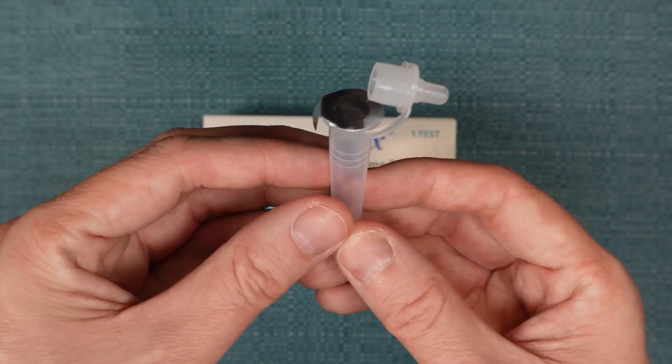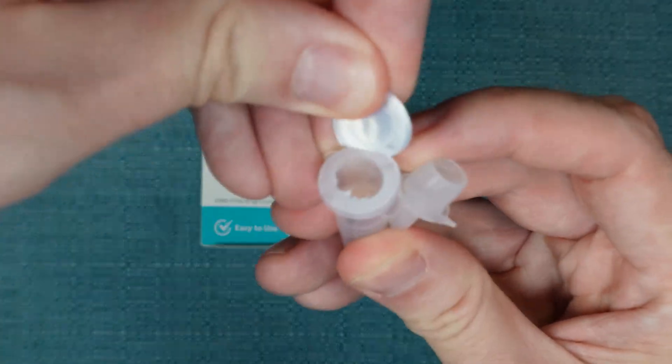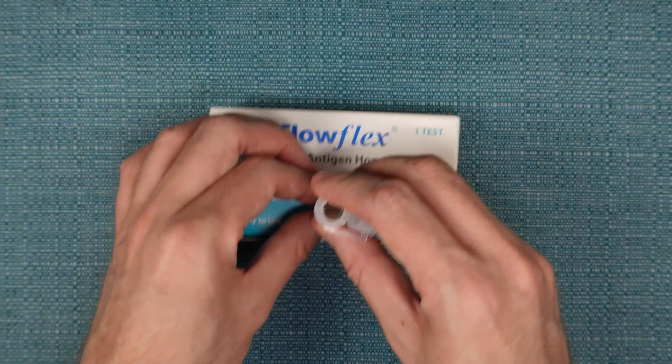Then pick up the tube and peel the tape off of it, and insert the tube into the hole that you made on top of the box.